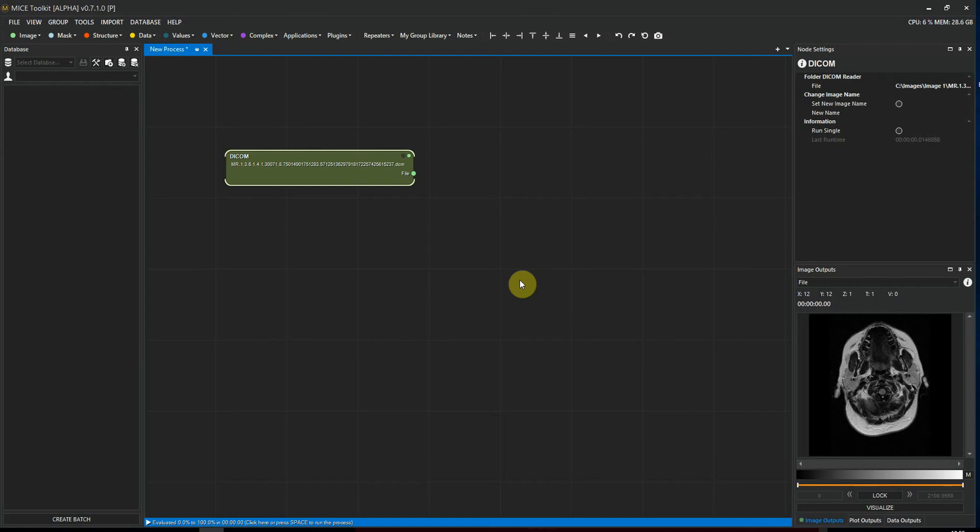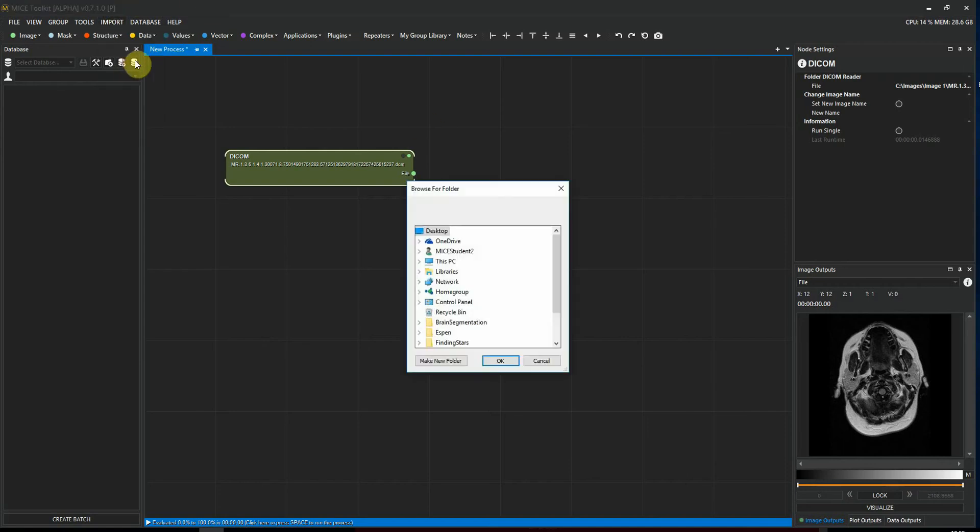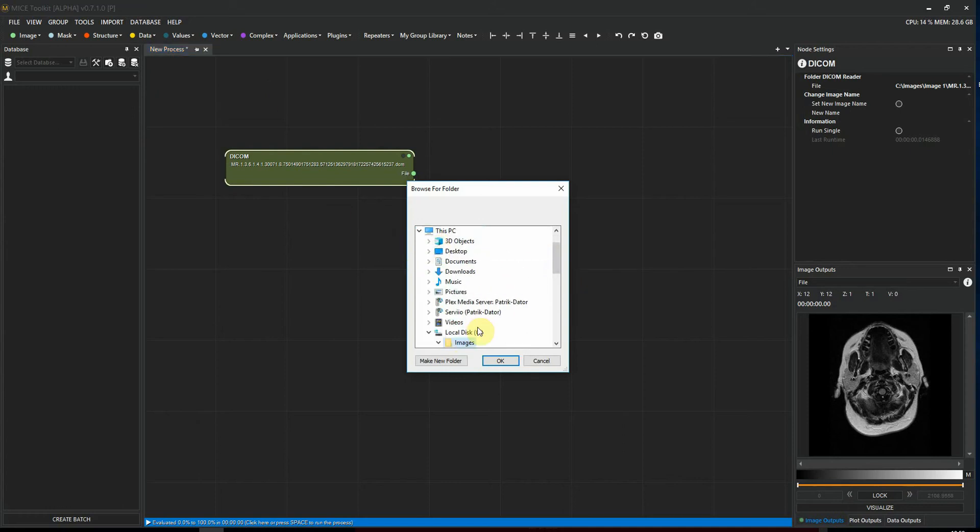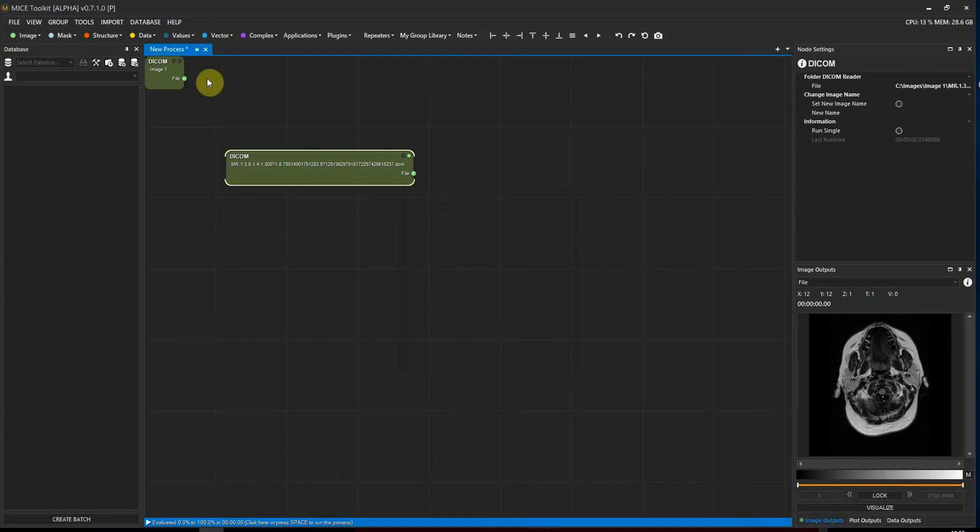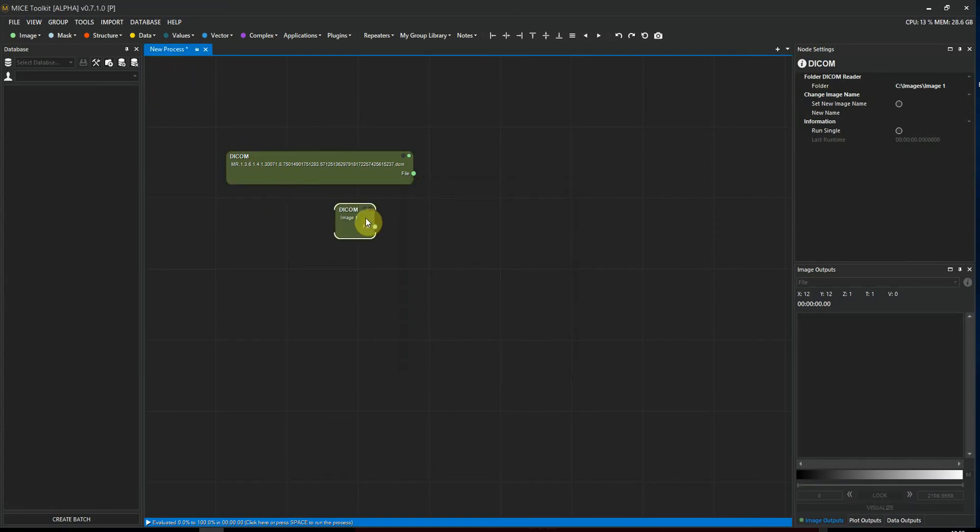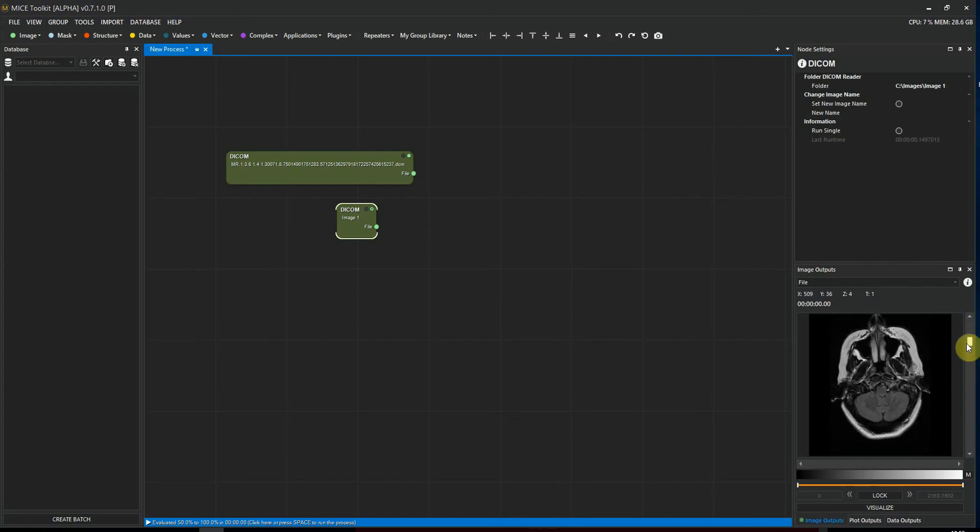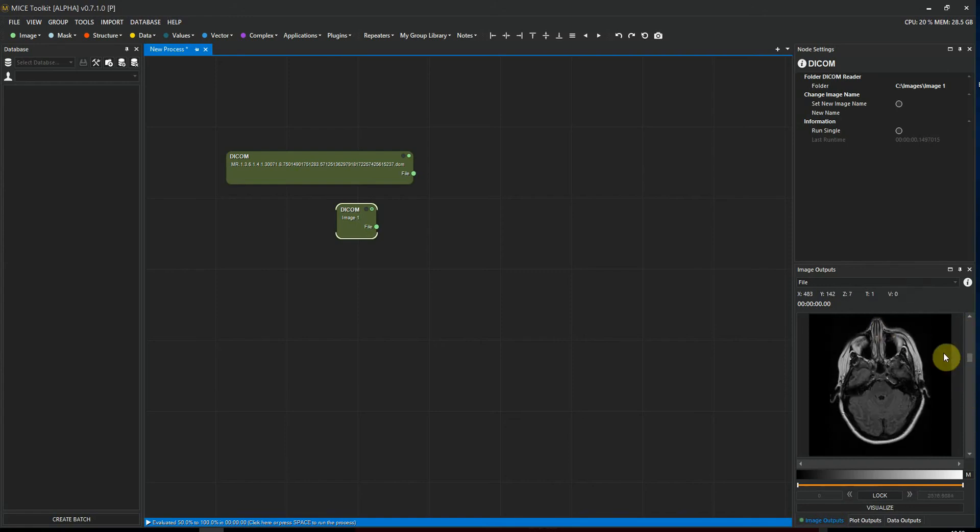We can do that by going to Import and selecting DICOM Folder, and we navigate to the folder and select OK. We execute the workflow by pressing spacebar, and now we see that we have an entire volume instead of just a single slice.